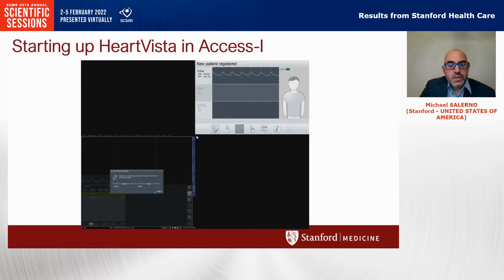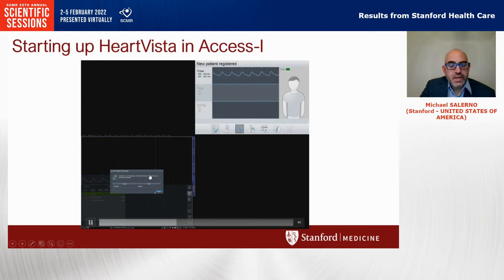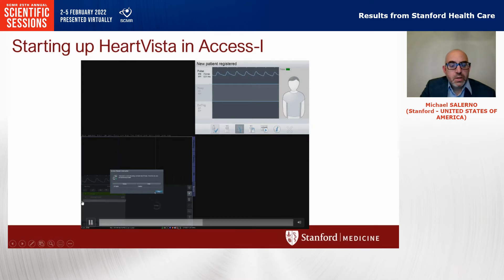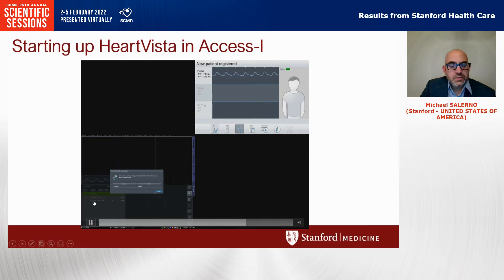When we first set this up and start Access-I, this gives control of the scanner to the HeartVista framework. For the Siemens sequences we're using, the system will load in the sequences for T2, T1, and the CINE imaging.